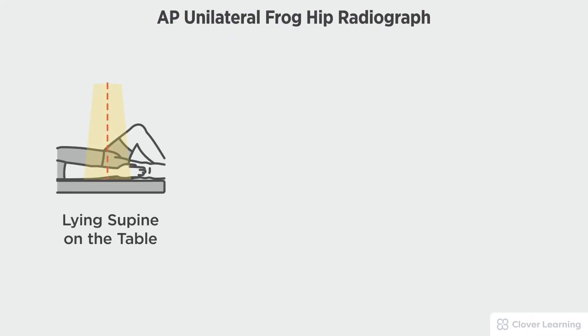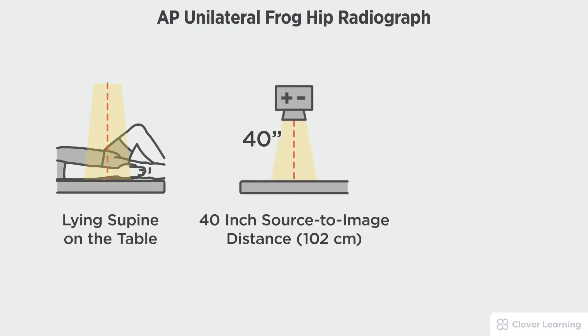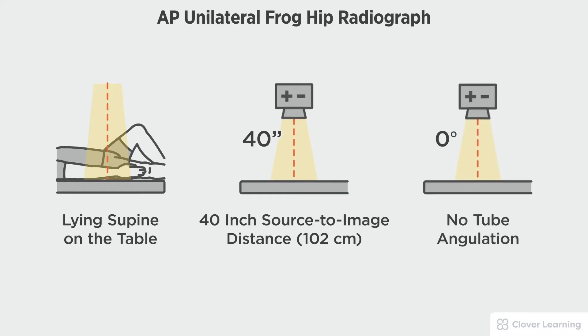In this view we will be demonstrating an AP unilateral frog hip. The AP unilateral frog hip should be performed with the patient lying supine on the table with a 40 inch source to image distance and no tube angulation.